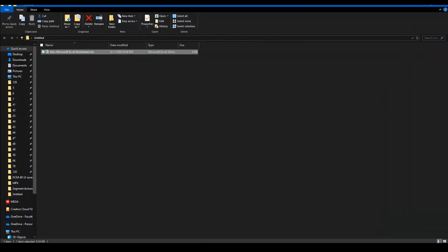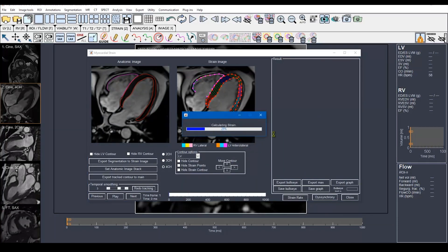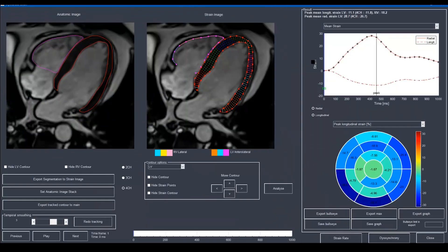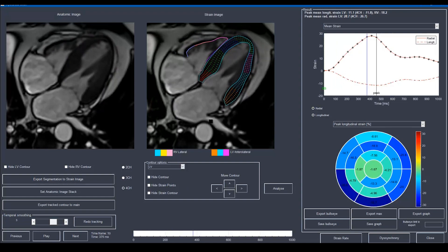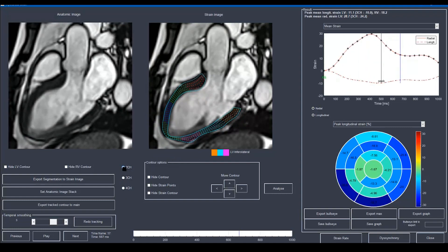I will close this window to go back to the main software interface to show the longitudinal strain results. From the same tab, Strain, and the same icon — Start Feature Tracking Long Axis Analysis — I will click on it again and it will calculate the longitudinal strain. These are the peak strain values: the peak longitudinal strain for the LV and RV, and the segmental longitudinal strain in each of the 17 myocardial segments, including the apex for the longitudinal strain. You can also visually assess the whole motion and strain values, and from the play icon you can play the cine movie with the tracking feature on — for four chamber, three chamber, and two chamber.